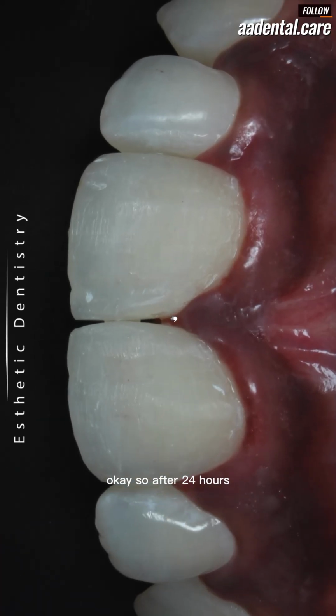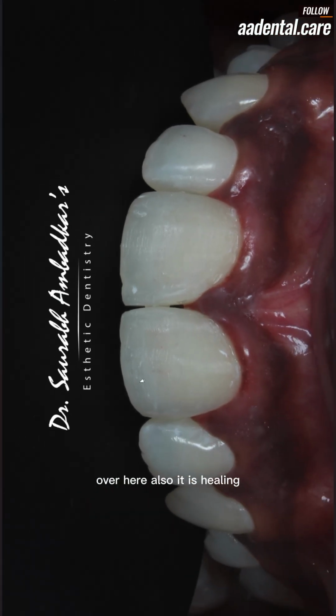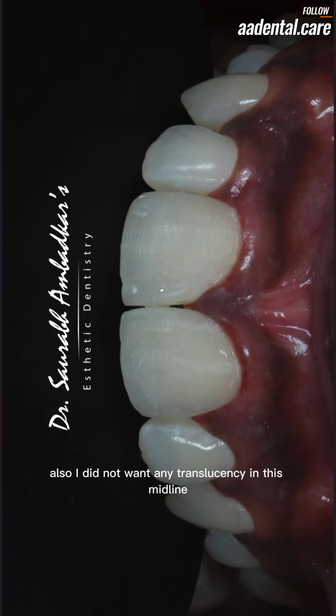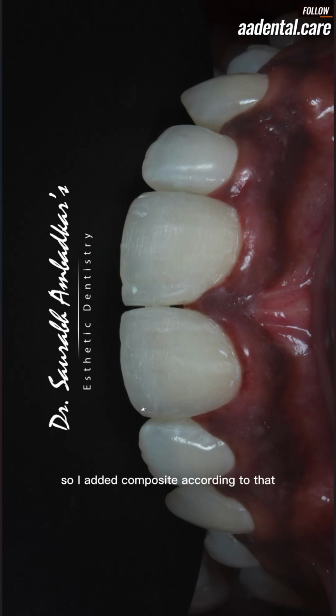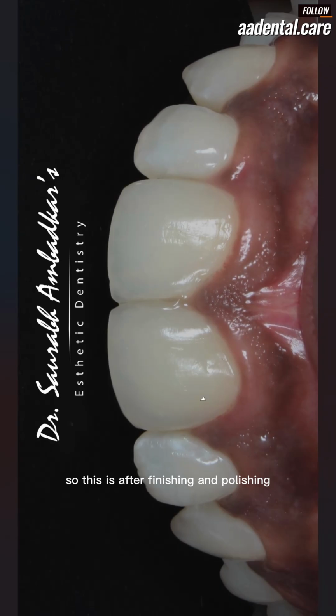So after 24 hours you can see the situation over here. The gingiva is well engineered and adapted with my new composite. You can see the papilla also, it is healing. Over here also it is healing. Without polishing also you can see the translucency over here. I have matched the shade very well in this region also. I did not want any translucency in this midline, this proximal area, but I wanted the translucency in the incisal edge area. So I added composite according to that. Then this is after finishing and polishing.